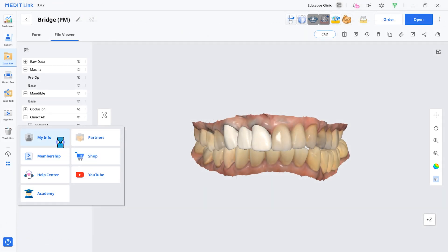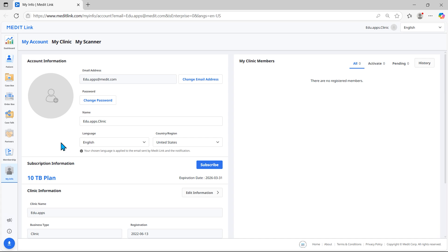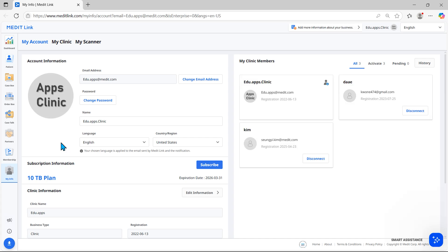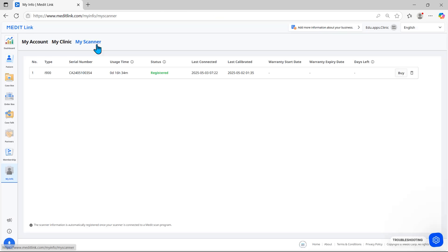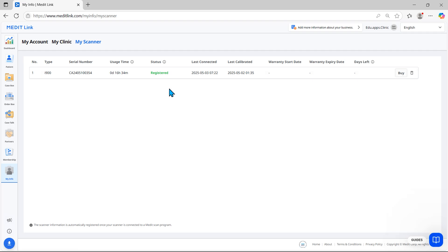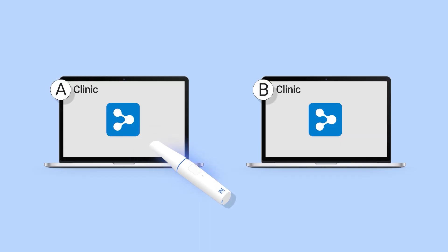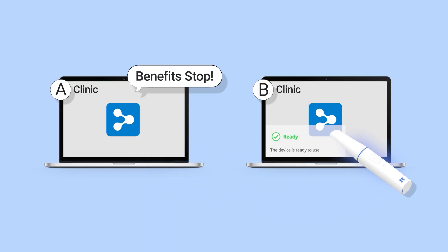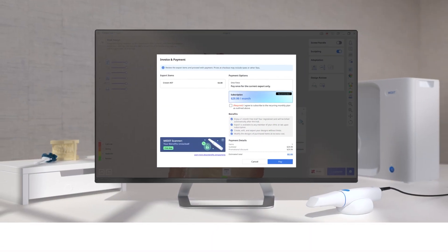In My Info, go to My Scanner to check the scanner registration status. To receive benefits, your clinic or lab account must have at least one registered scanner. If the scanner's registration status changes, benefits may be discontinued. When the scanner is registered to another clinic or lab account, benefits stop as you're no longer considered to own one.